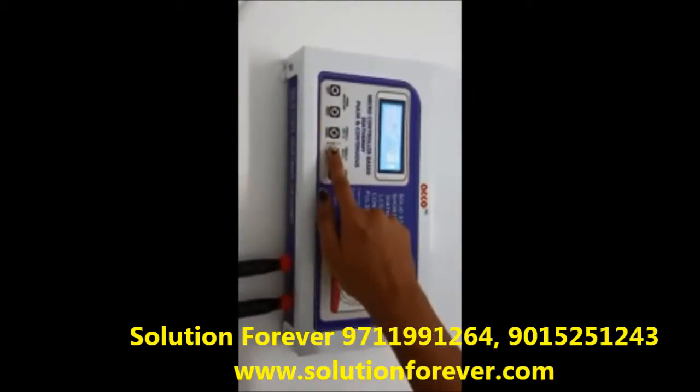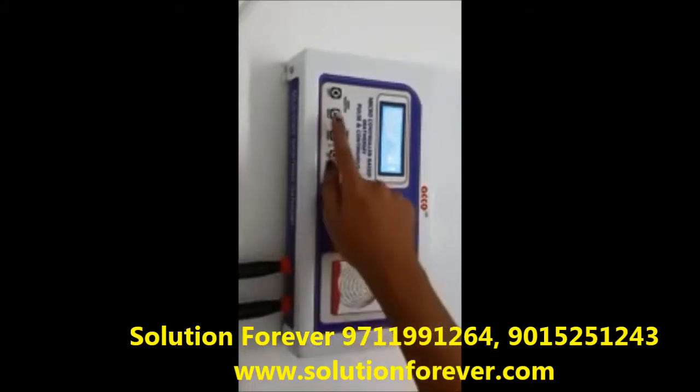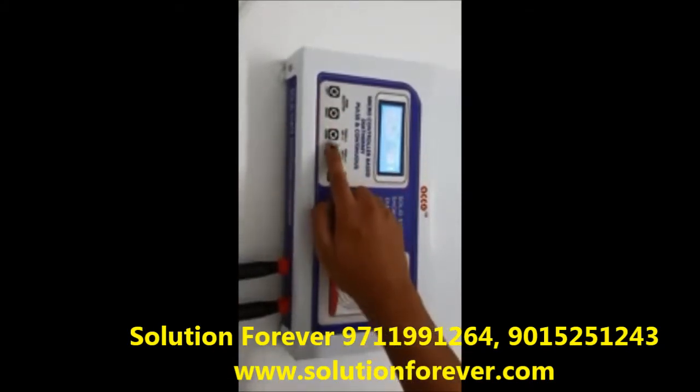Select the timer as per your need — timer up, timer down. Select the mode as per your need: continuous or pulse.